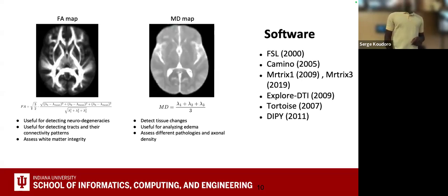And this is where we start to see some software popping up to show some propositions, how to modelize and how to use it every day. So the first software that arrived was FSL from Oxford, that arrived in 2000. It started to offer tools to modelize this characteristic.